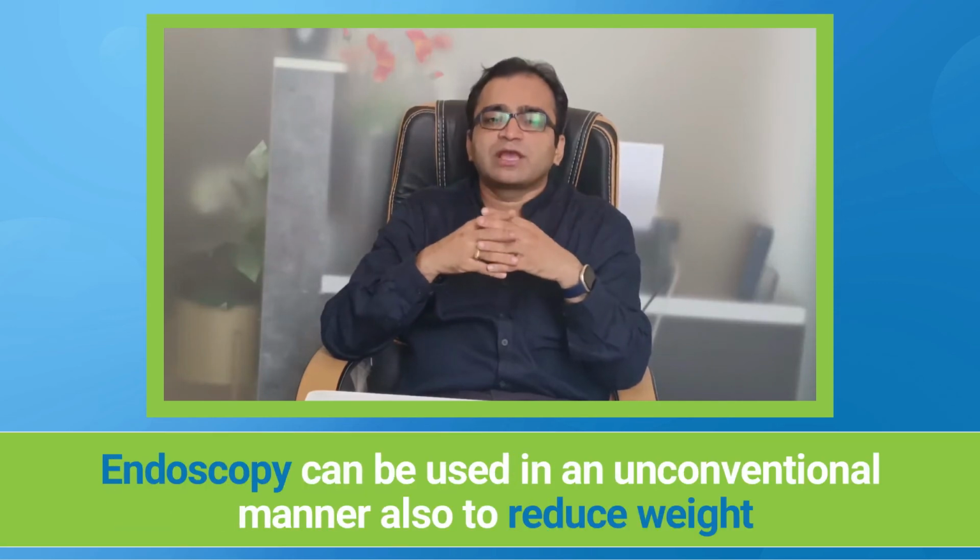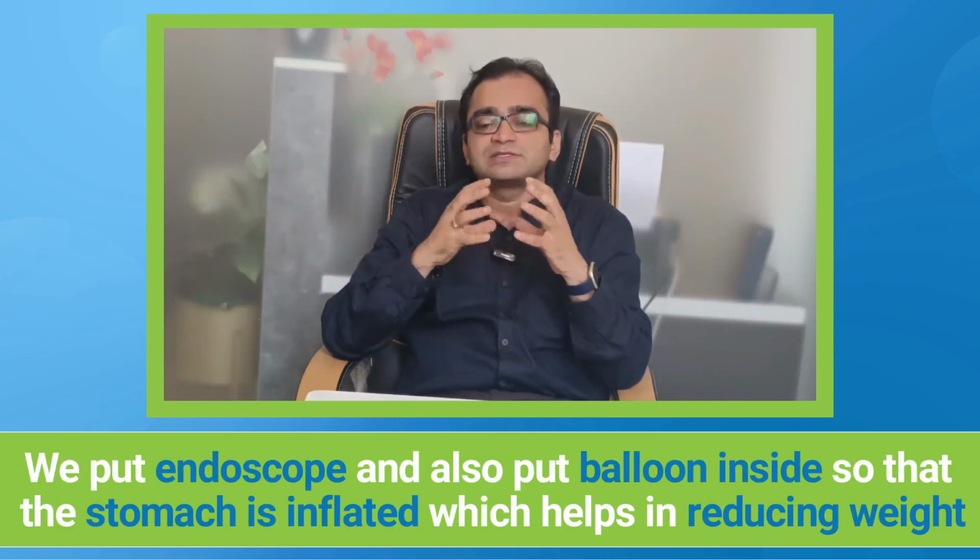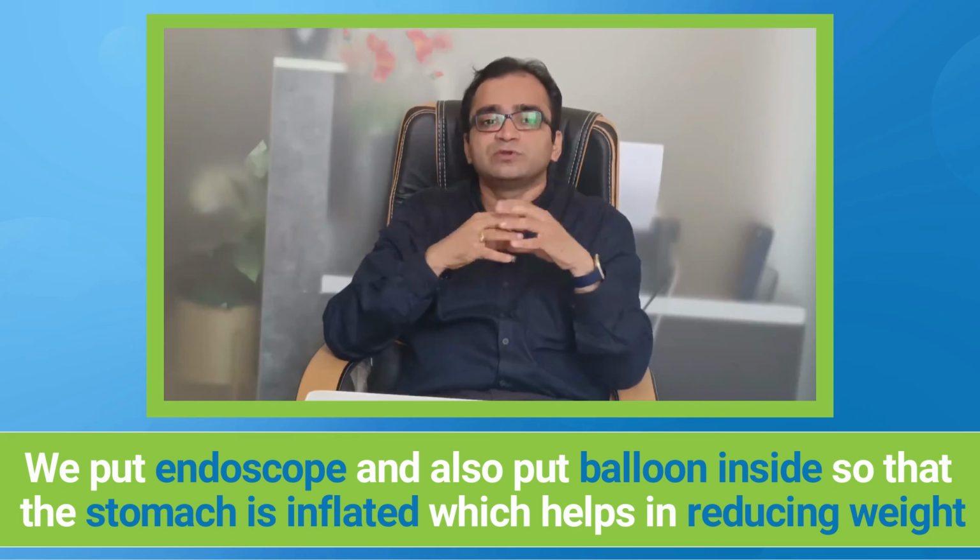And lastly, there is ERCP. I already mentioned that somebody who is having a stone inside would require an ERCP to clear that passage so that the jaundice comes down. Apart from that, endoscopes can be used in an unconventional manner also to reduce weight. We put in an endoscope and we put in a balloon inside so that the stomach is inflated, which helps in reducing the weight.